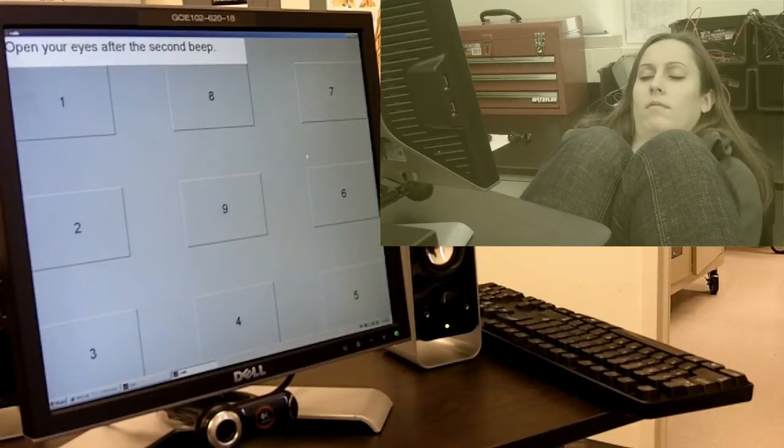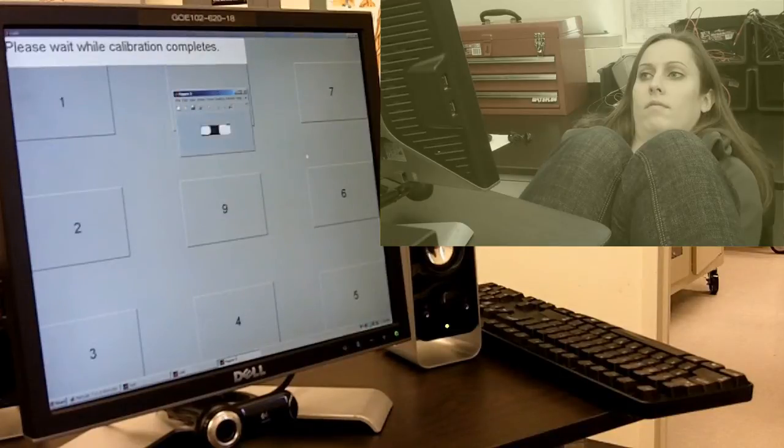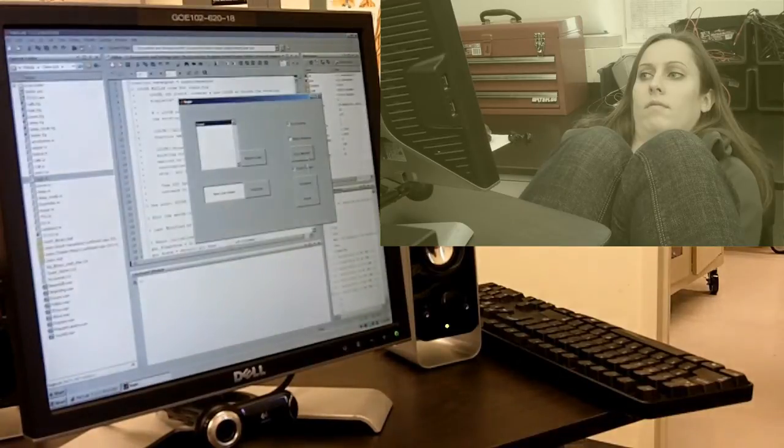Good. Now we're going to use the eye tracking based keyboard. So Hannah has the ability to look around, all around this keyboard, and select the bin or the letter that she's looking for. We started about Thanksgiving of last year. That's when our group came together, and we actually got our project assignment and what they wanted us to do.